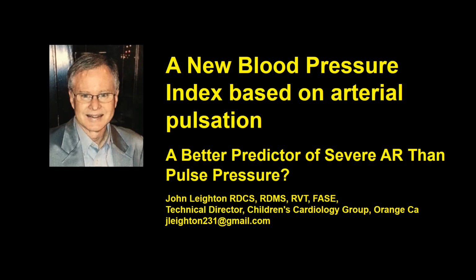Hi, thank you so much for checking this out. We've got a new blood pressure index based on arterial pulsation. It's just 10 minutes.